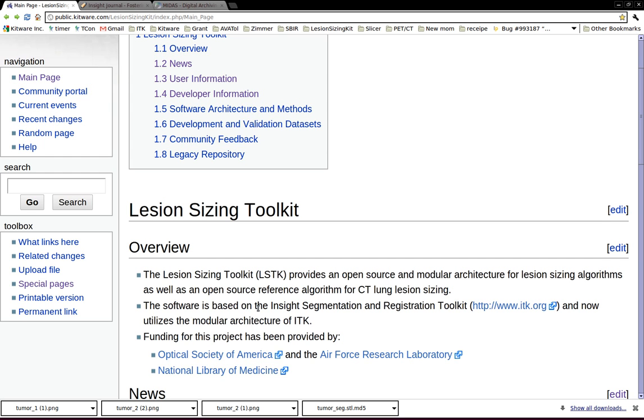Welcome to IGK Barcamp series. This video is for community members who are interested in using Lesion Sizing Toolkit to segment tumors from CT images, for example.